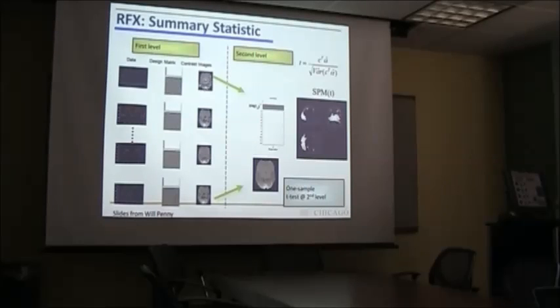It shows here these contrast images, so images for each subject that at each voxel have a value of how well one part of your model fitted the response better than some other part of your model. And you would use these contrast images at a second level, group level analysis. In this case, maybe just to run a one sample t-test. So you just want to see, sticking with our example, if this was a contrast image for faces versus houses, right? And you would test it at a second level, you might see across this group of subjects, you have this activation in the visual cortex.